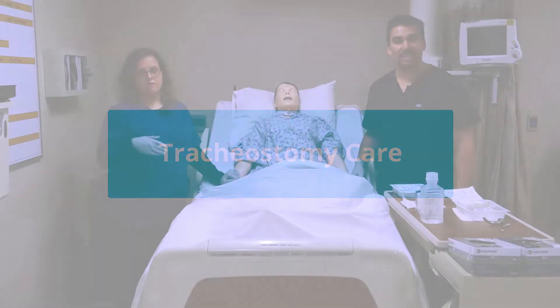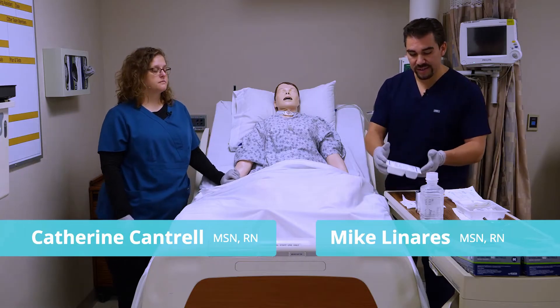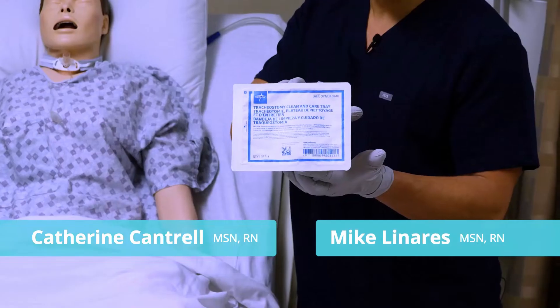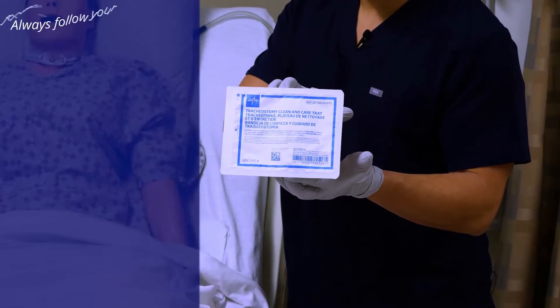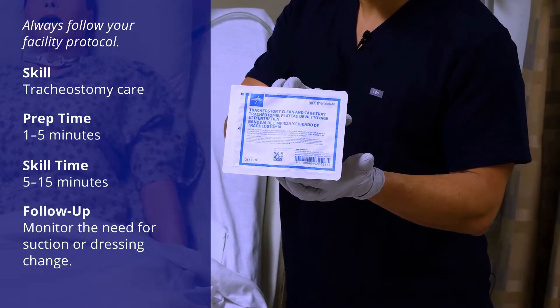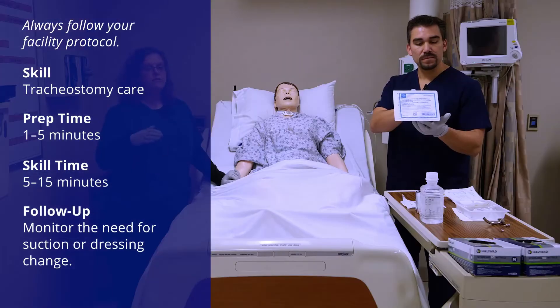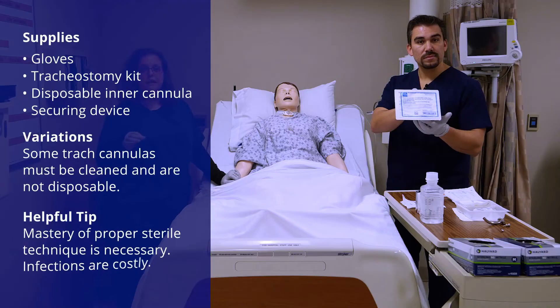We're going to do tracheostomy care now. We have a lot of ingredients, so Kat, bring us through this one. This is just a tracheostomy kit. If you're using a disposable cannula for your patient, some of the supplies that come in this kit you're not going to need. But if you're using one that has to be cleaned or is a permanent type of device, then you're going to have to have the whole kit.